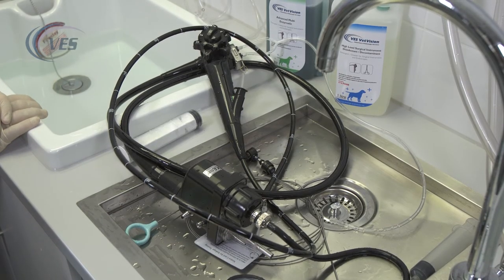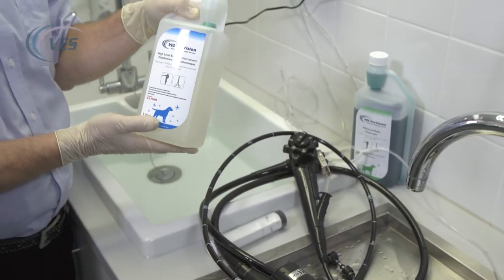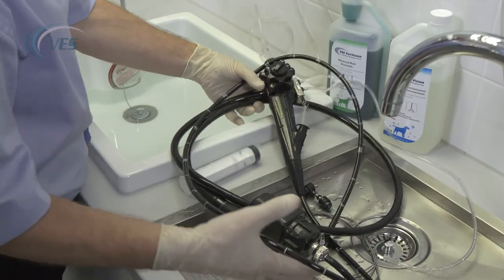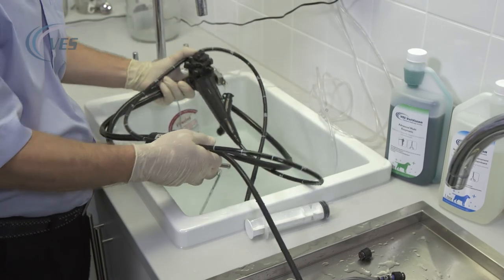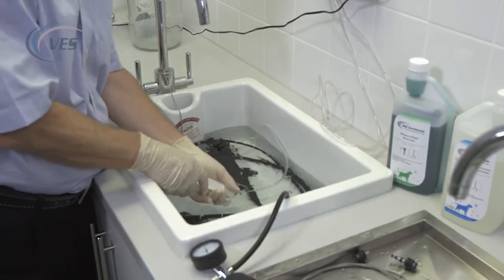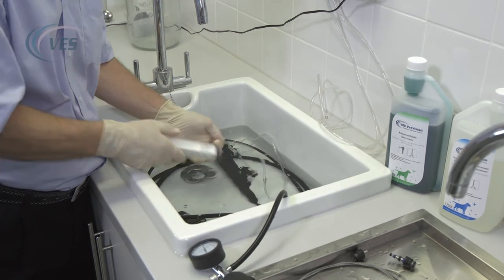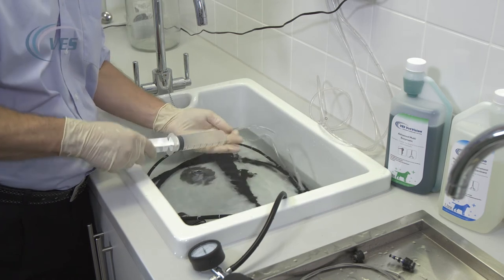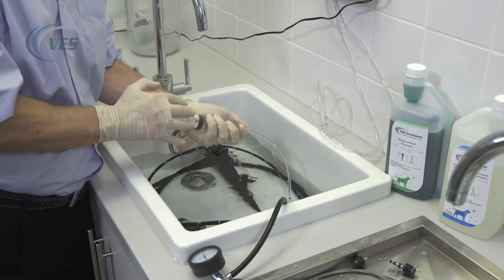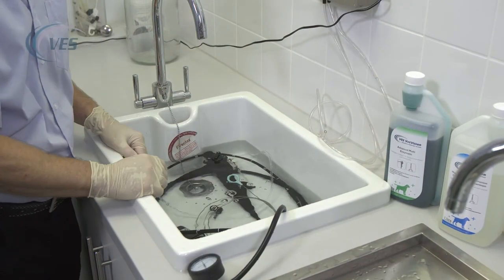You're going to flush the scope through with disinfectant in order to eradicate the enzymatic and any pathology that may be left in there. Again, follow the manufacturer's recommendation in terms of dilution and your soaking time. Keeping an eye on the leak tester, the scope becomes fully immersed. We're not going to brush through this time. Just take the syringe and flush through three or four times until we flood the scope with disinfectant. Once done and happy, leave the scope in the disinfectant for the rest of the allotted time given by the manufacturer's recommendations. At this point you can also put any forceps or brushes into the disinfectant.